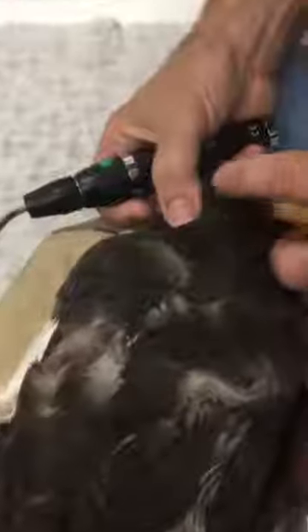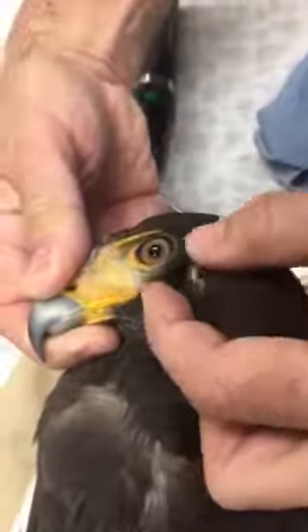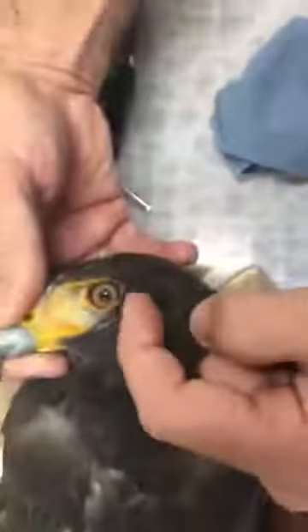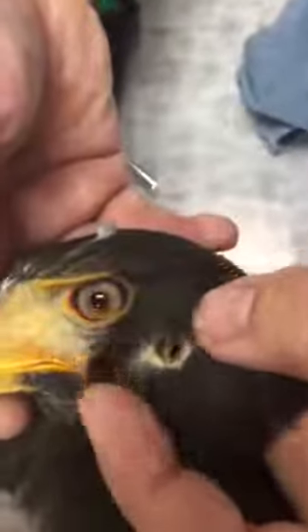Looking in her nares, which are a bird's nostrils. Finding the ears — nice and clean. Usually to find a bird's ears, you go in line with the mouth, behind and below the eye. Nice and clean there.